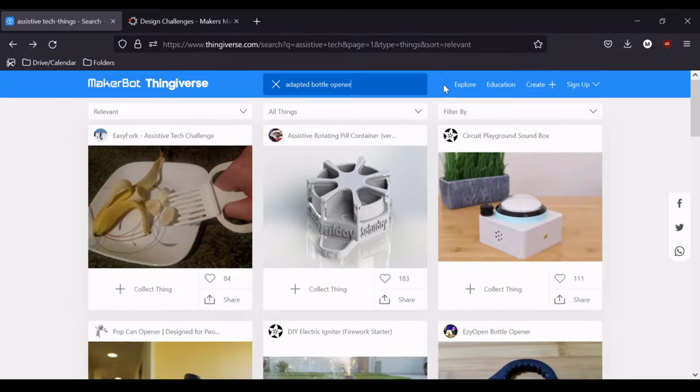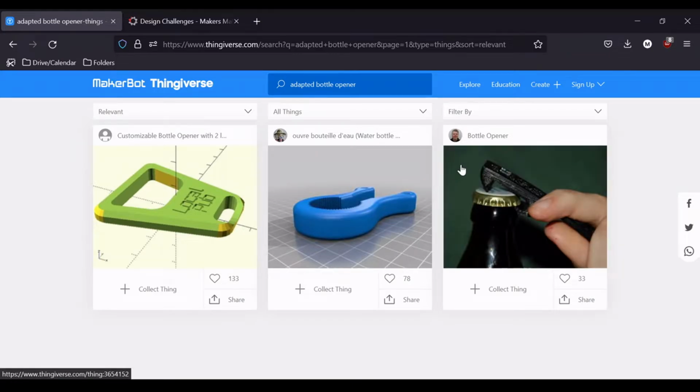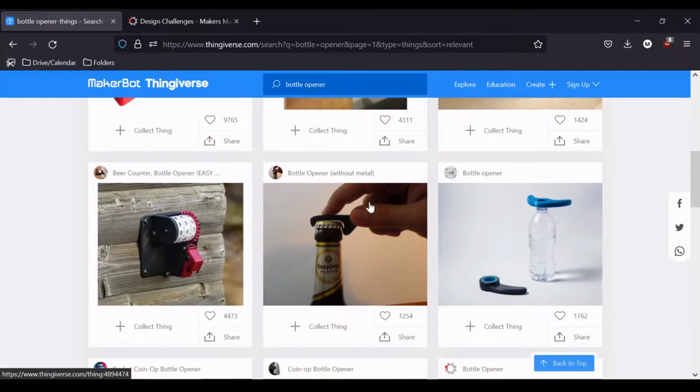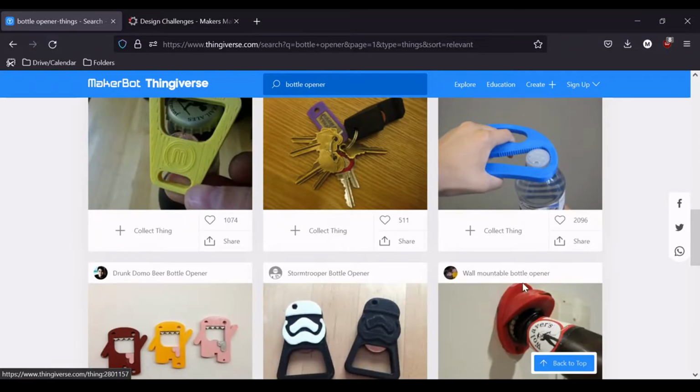In this case, let's search for adapted bottle holder and look through a few of the designs. Now I'm looking through a few of these designs, and there are a few things that I'm looking for, like interaction with the public through likes with the design. The more people have interacted with the design, the more support it's likely to have. In addition, I can look for individuals who have done testing on their prints.